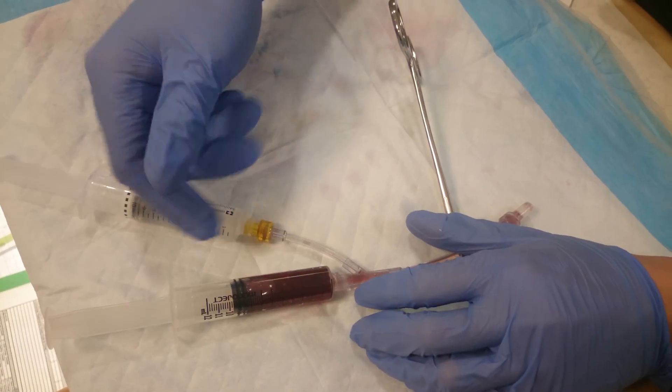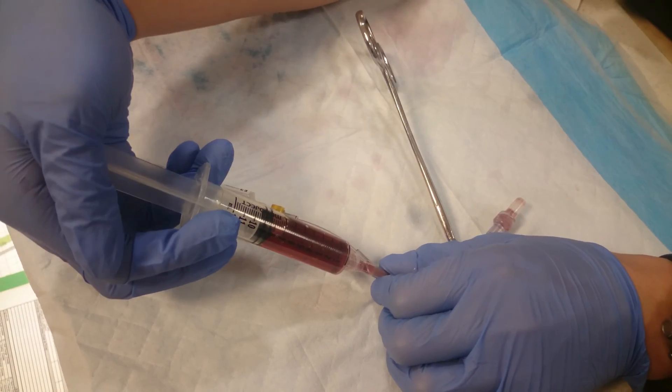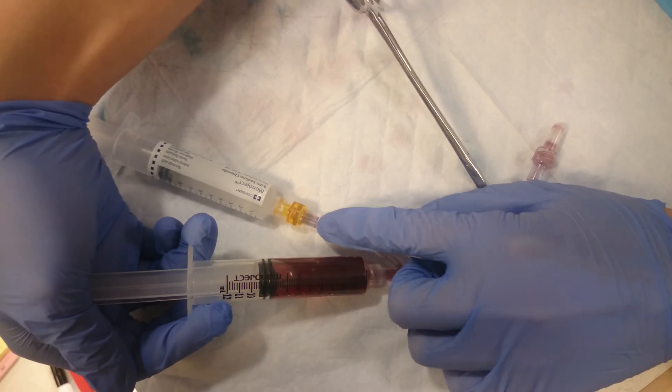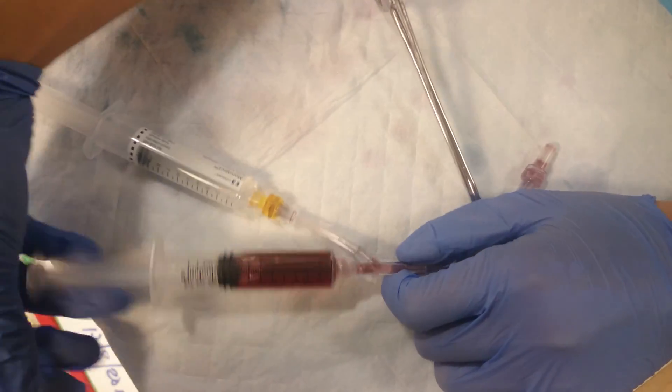In this example, where the Dilaudid is hooked up the correct way, if you try to push down on the Dilaudid you can see right here that it cannot go back into the anti-siphon valve. And that concludes your video.